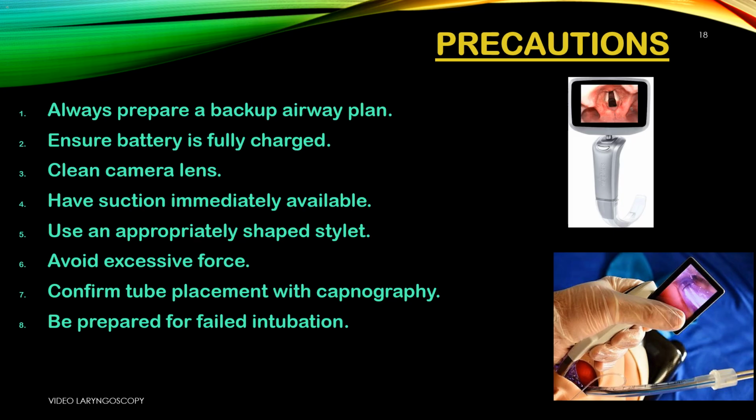Precautions. 1. Always prepare a backup airway plan. Have a plan B and C ready. If VL fails, you need bag mask, bougie, or surgical airway immediately. 2. Ensure battery is fully charged.